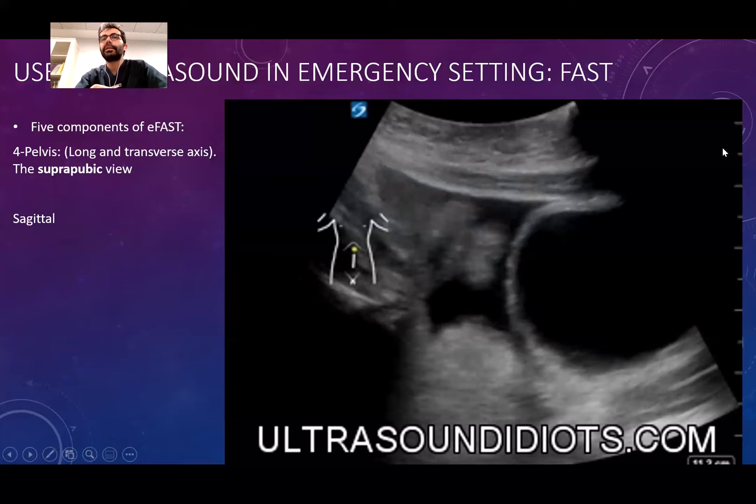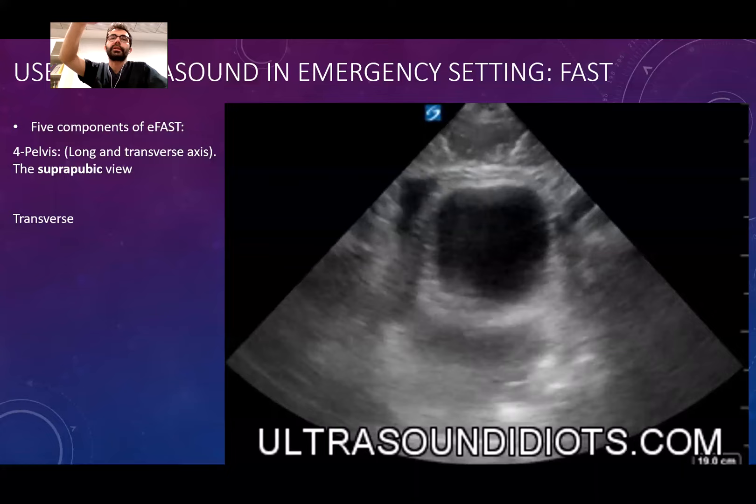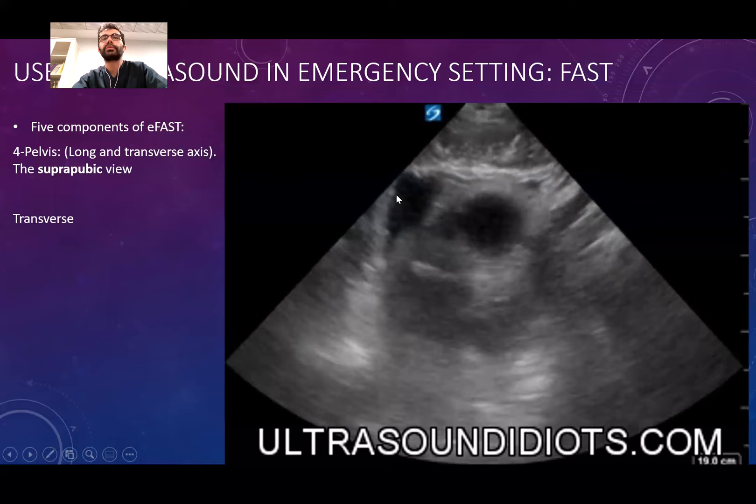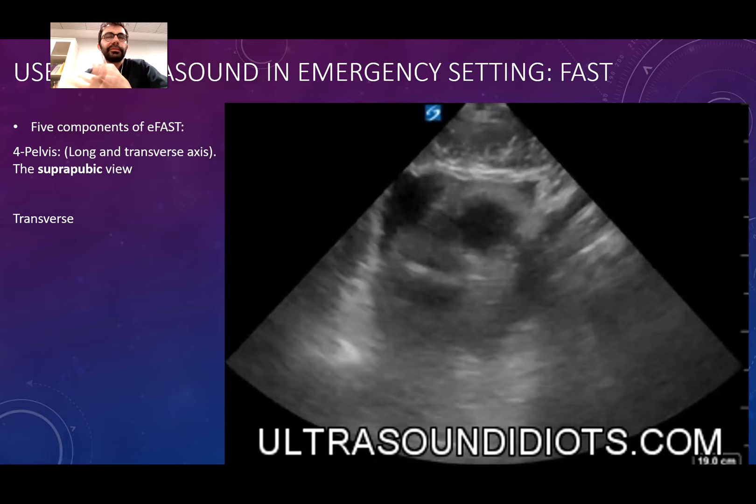When there is free fluid inside the pelvic cavity, it is easy to see — the bowel walls start to swim inside the fluid. Around the bladder sac I start to see fluid density, and inside that fluid there are bubbles — the bowel walls — swimming around.